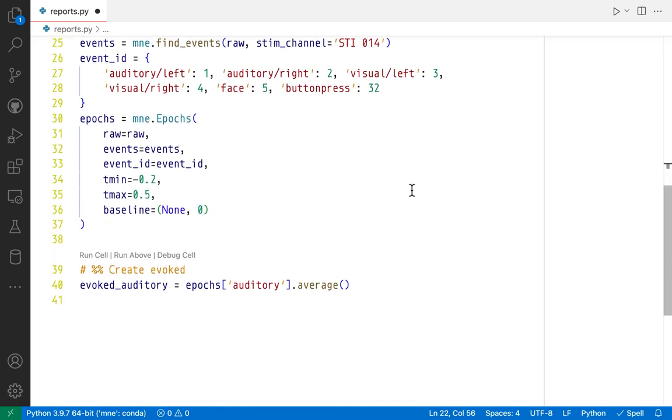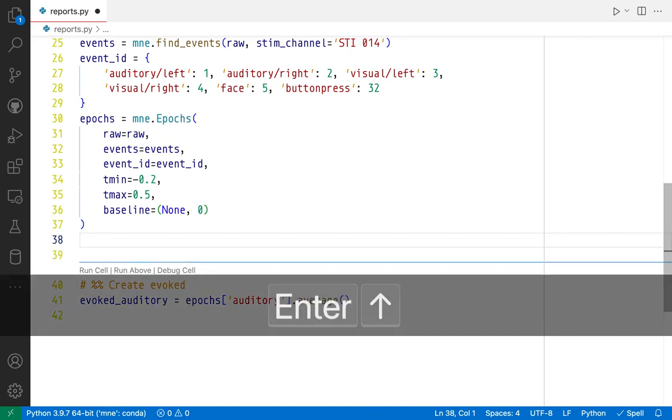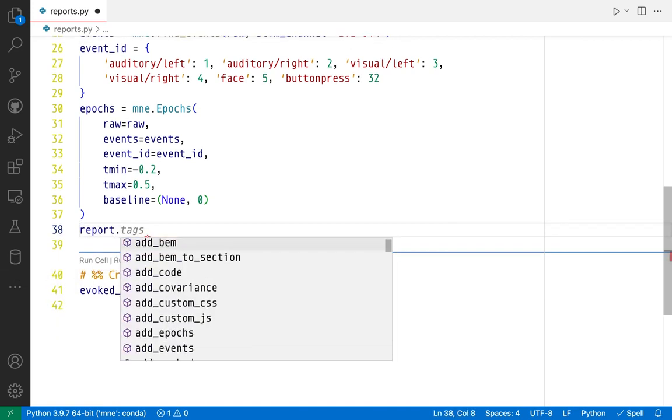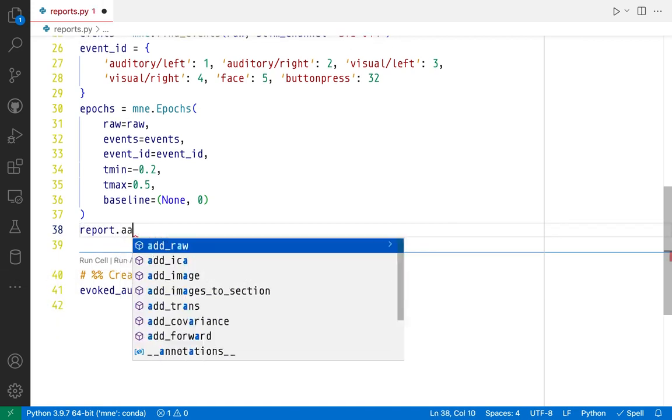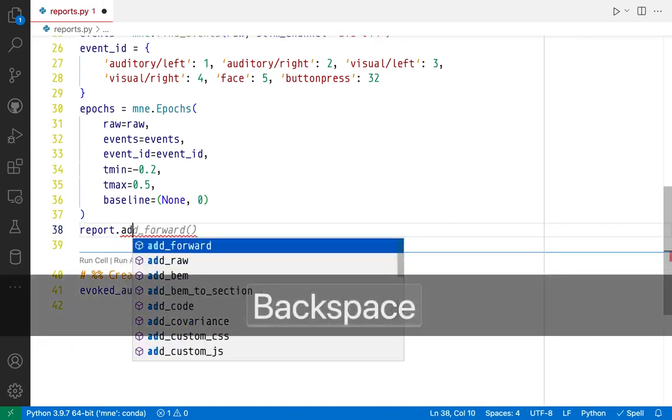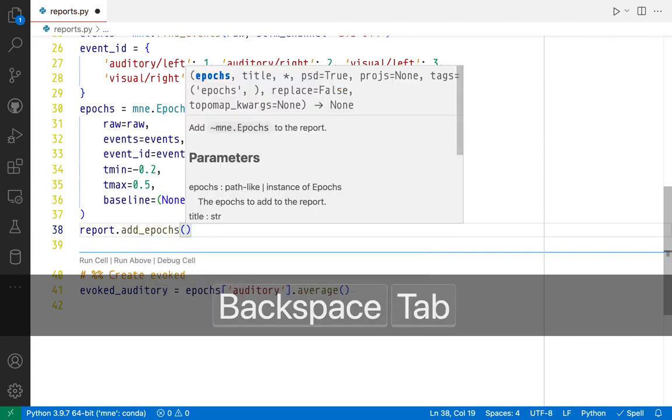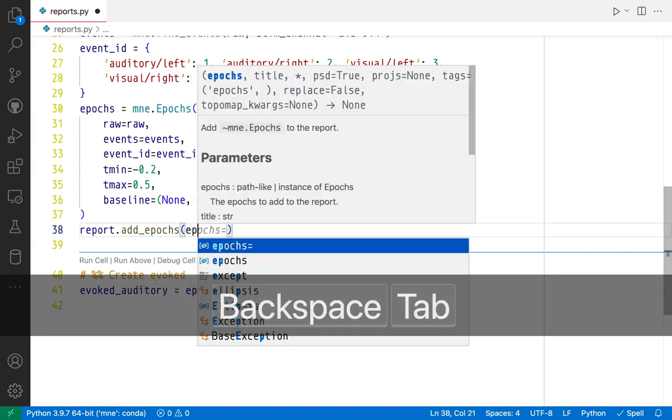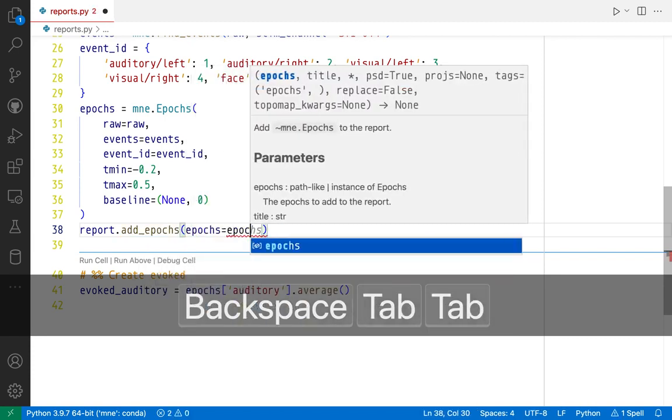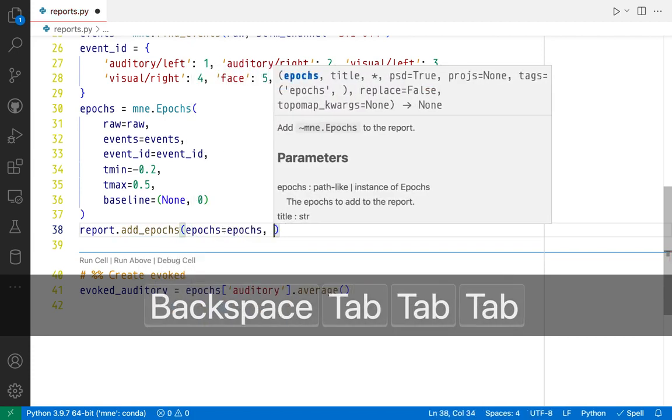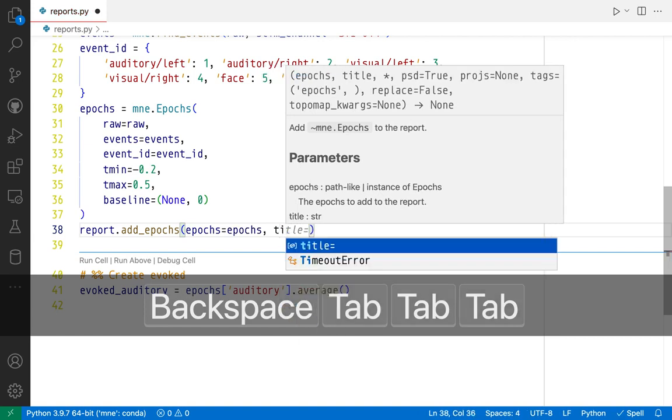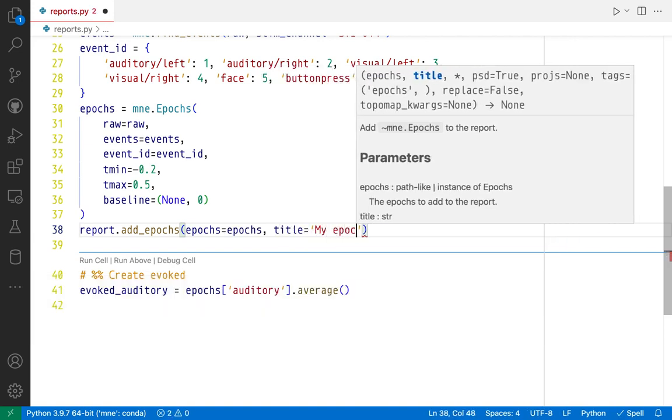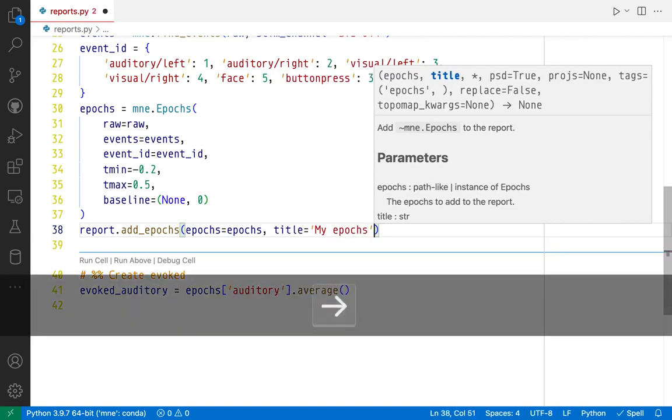Let's move on to the epochs. To add epochs to the report, we're going to use method add_epochs. First parameter it expects is an epochs object. Second parameter is a title, just going to call it my epochs.